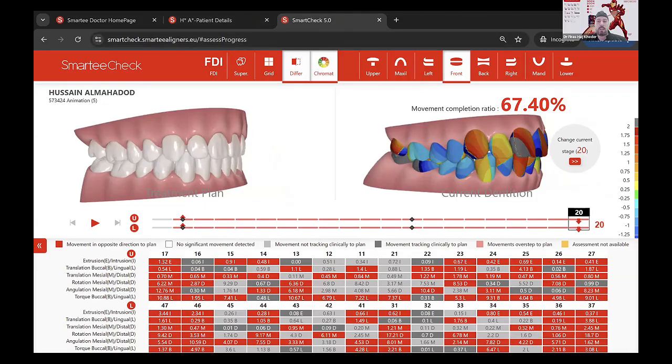And now let's go ahead to the other patient. And here on this page, you're gonna go ahead and press oral health report. And then you can choose new report. And then you can fill the information. For example, because I already submitted the case, I cannot choose the case, but you can choose the case stage, if it's initial, if refinements. And here the picture is already uploaded, so you don't have to upload it again. After that, when you submit it, you can see the results here, the ID, the case stage, the submission date, and you can view it from this button.